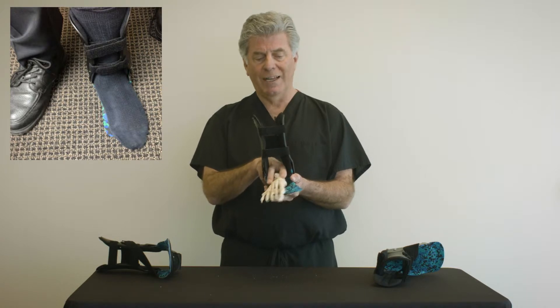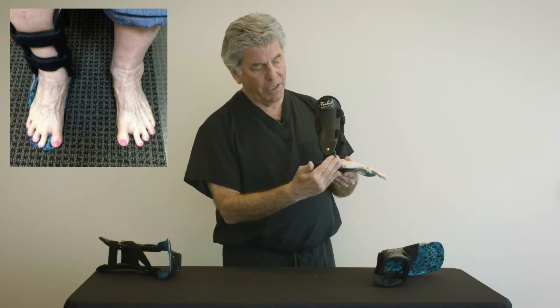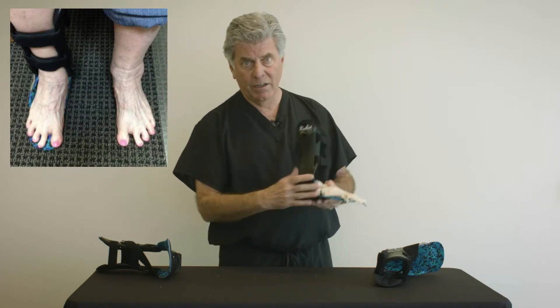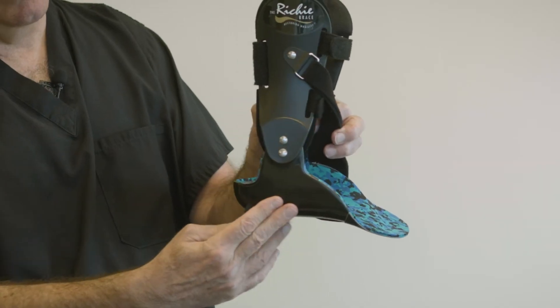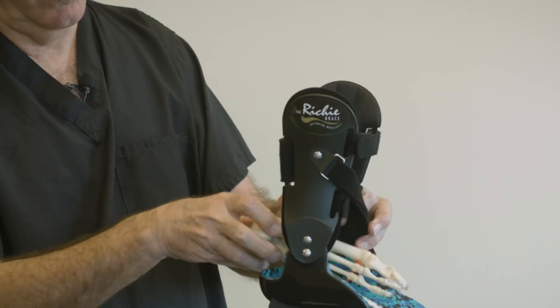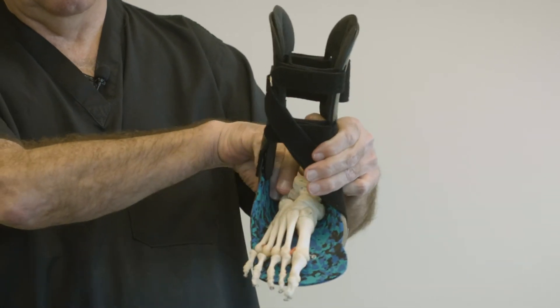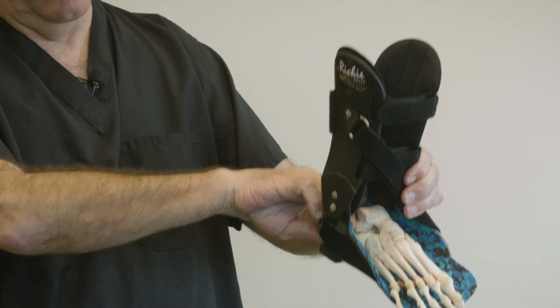This slippage laterally is best controlled with a wall or barrier applied to the foot plate of the orthotic. Essentially, that's what a lateral flange is — applied to the brace or the foot orthotic. The flange provides a barrier to restrict lateral forefoot abduction.